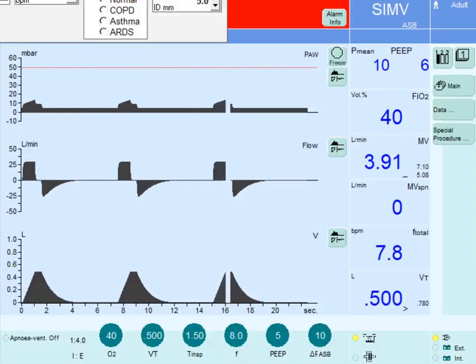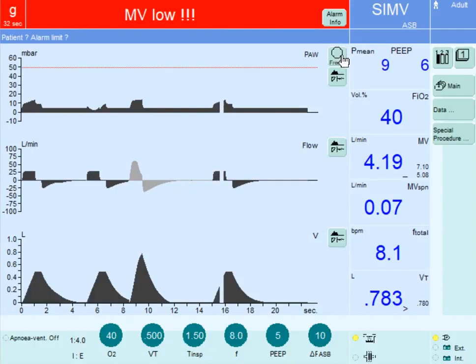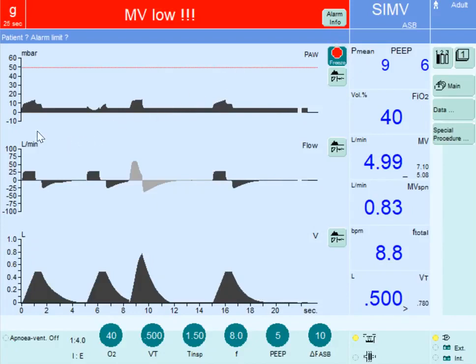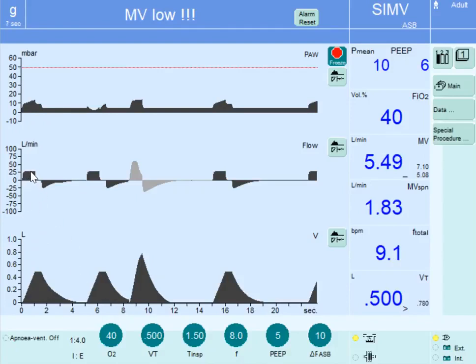Let's see this in action. The first breath is mandatory, then the circuit is open for the patient to initiate a breath. Analyzing the waveform: the first breath is the mandatory breath that occurred after 7.5 seconds, triggered by time. It is a mandatory breath given with a tidal volume of 500 ml and a flow rate of 30 liters per minute.